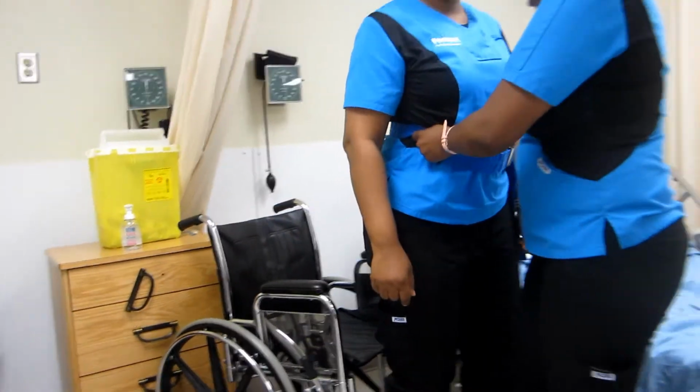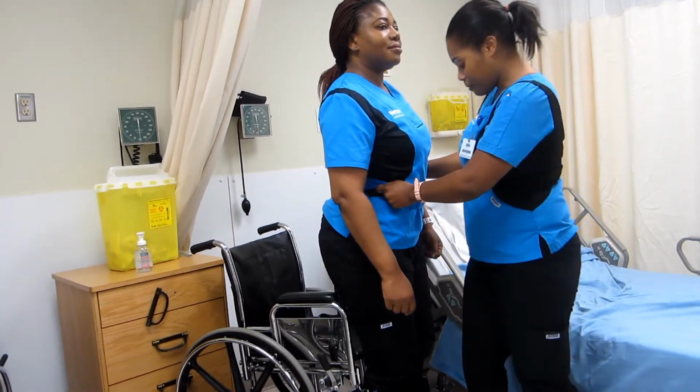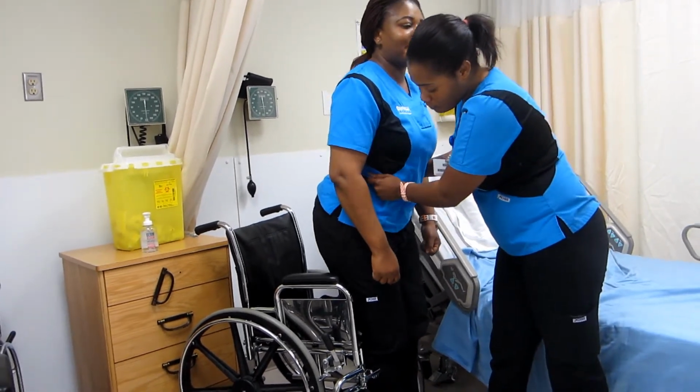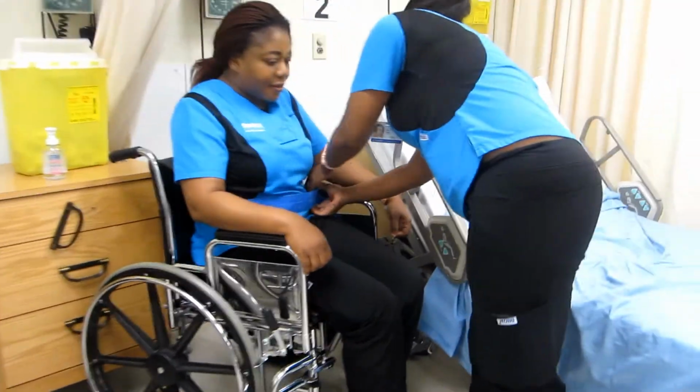Okay. And step back. Can you feel the wheelchair at the back of your knee? Okay, step back a little bit more. How is that? Okay? Alright, I'll get you to sit very slowly. Okay. There we go. And I'll just remove your transfer belt.